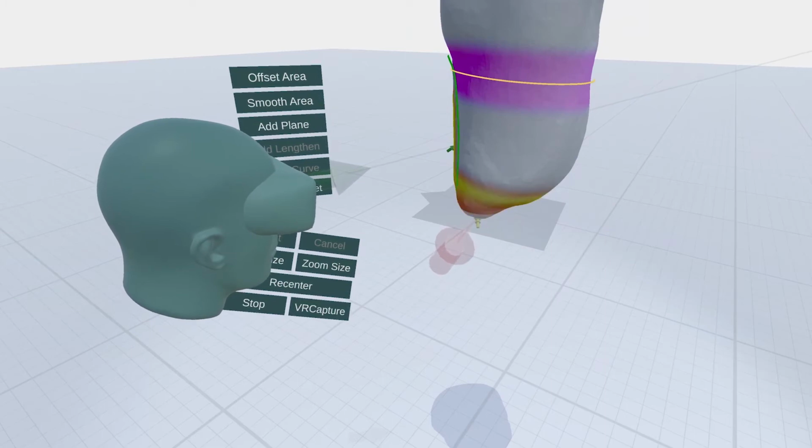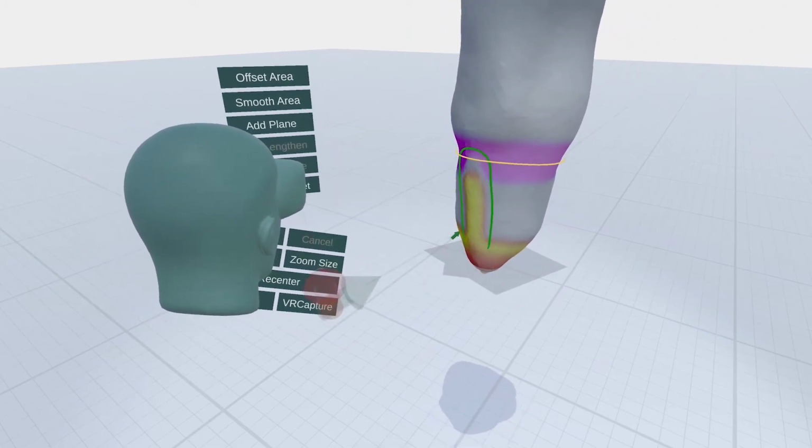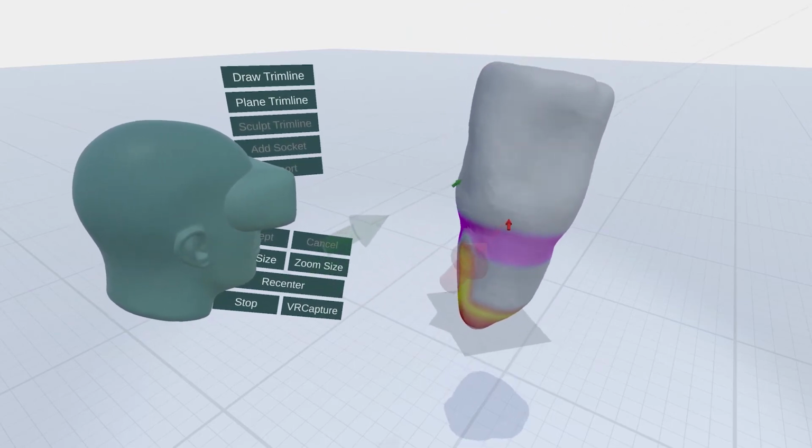Once the limb has been reshaped, the parametric socket can be added. The main thing left for the prosthetist to do is to create the trim line which defines the shape of the top of the socket.